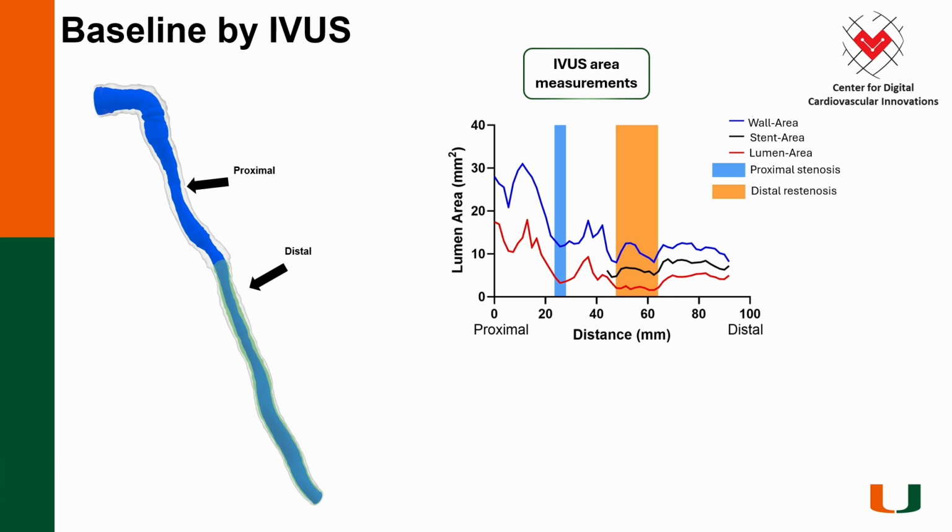We do a 3D reconstruction, again using here IVUS and angio, digital twin essentially, generation.